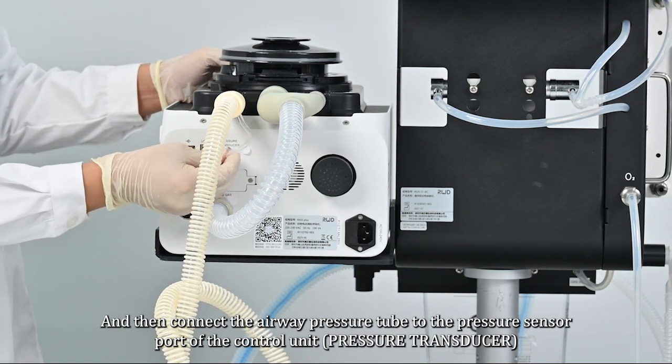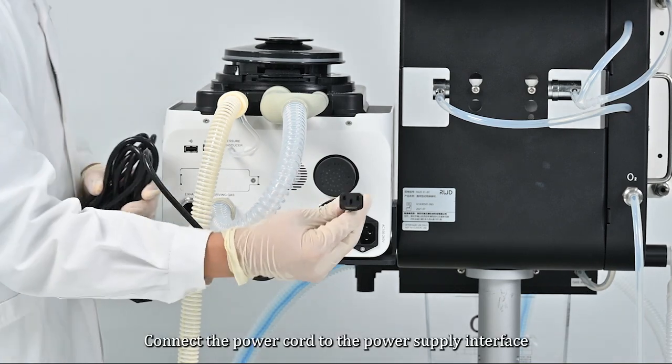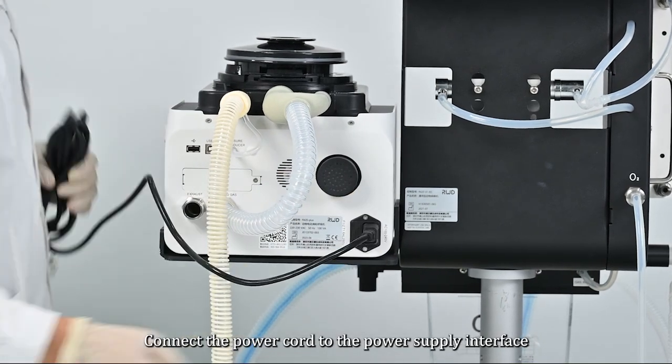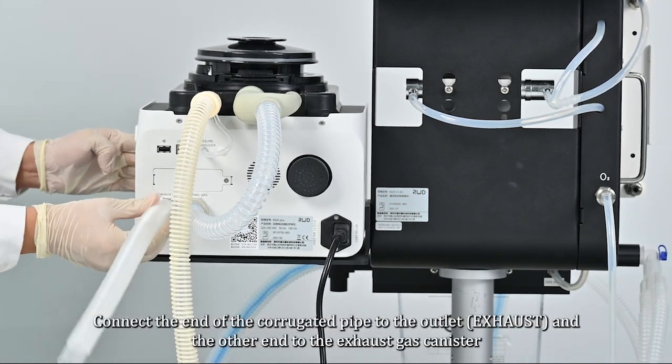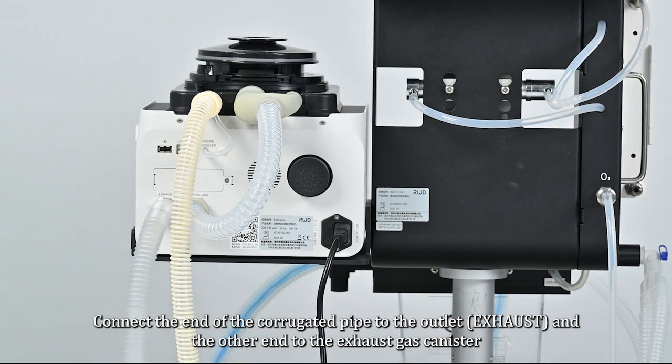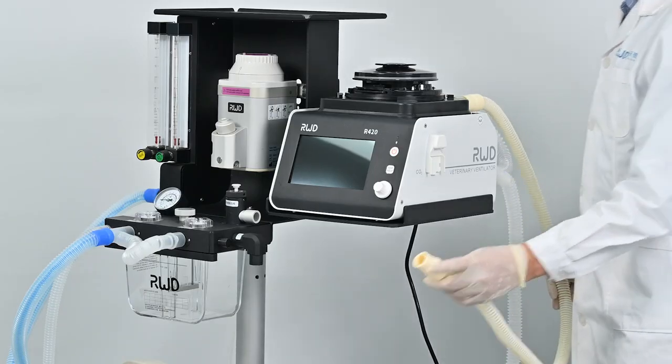Connect the power cord to the power supply interface. Connect one end of the corrugated pipe to the outlet and the other end to the exhaust gas canister.